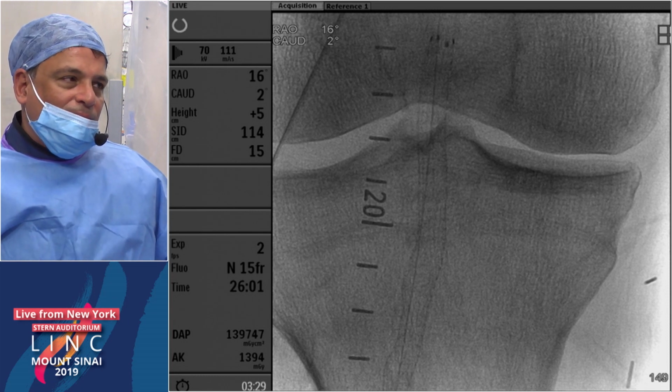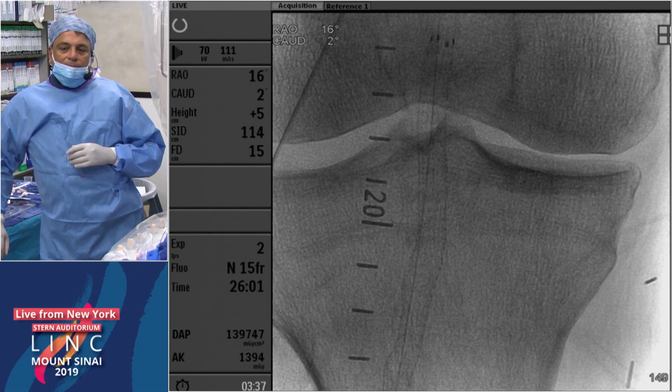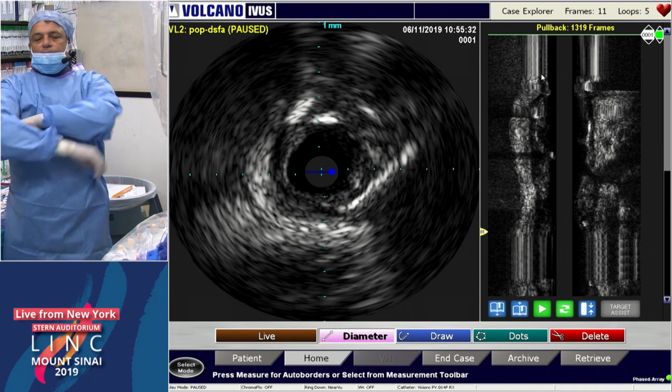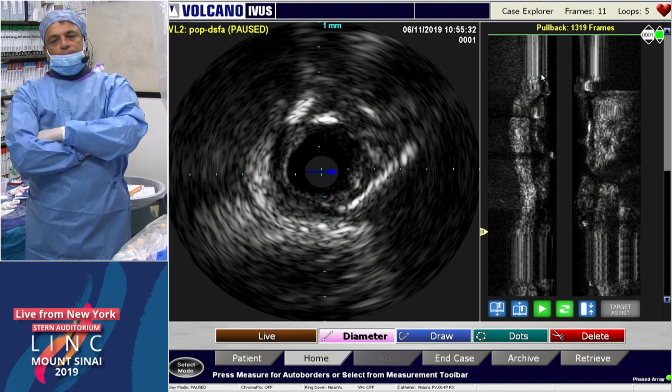I think it also depends on your calcium burden. If you're cutting directly into a big piece of calcium, you can kind of tell that you're often not doing that much. But because of the aggressiveness of the Hawk 1M device, or any of the Hawk 1s, I will oftentimes use the old Turbos or even sometimes the Silverhawk. They're phasing out the Silverhawks, but for soft lesions, you don't always want a very aggressive cutter. Right, so they have a nice range of devices, but I like some of the older devices simply because there are times when you want to be a little less aggressive.